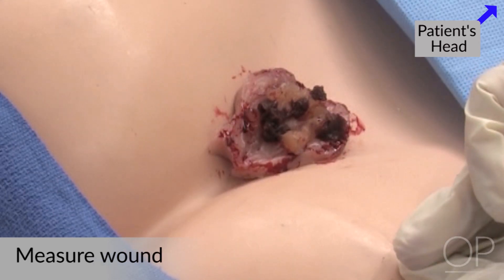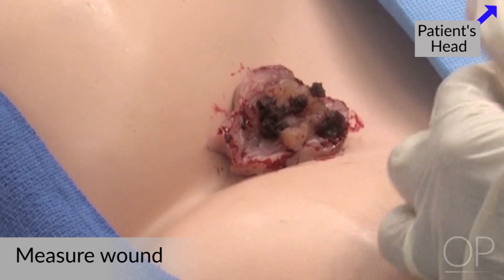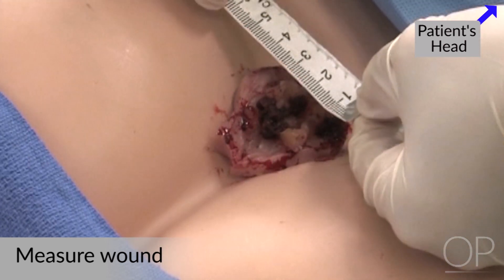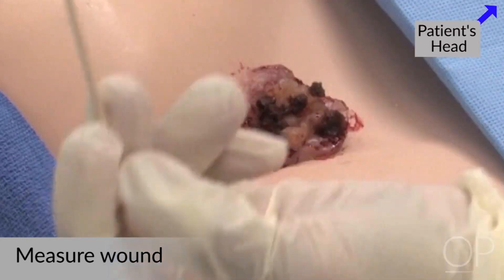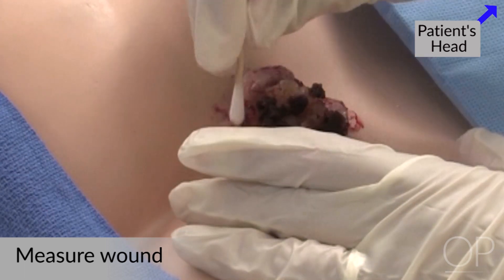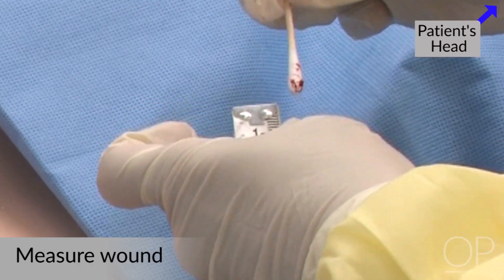To accurately assess this, we want to get measurements on this wound. You want to take a tape measure and in centimeters measure first the length, then the width, and then the depth of the wound. In measuring this wound, it's six centimeters long by four centimeters wide. To assess the depth, you can take a q-tip and go into the wound to assess its maximal depth in several areas and then measure how deep. In this case, this wound is one centimeter deep.